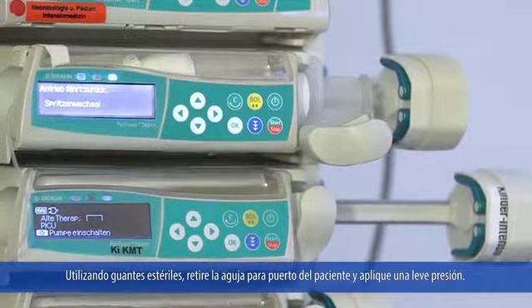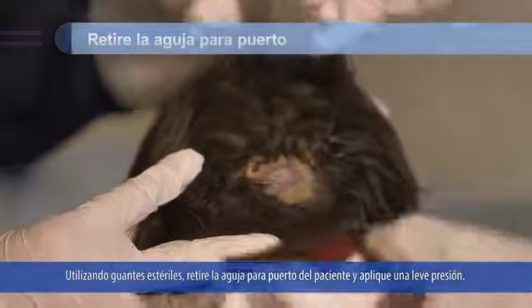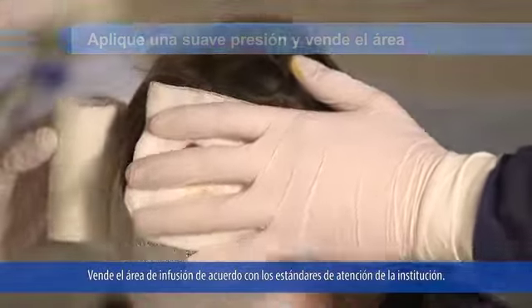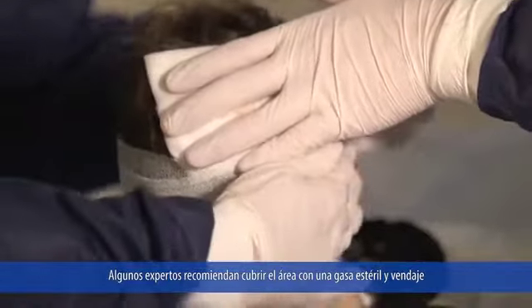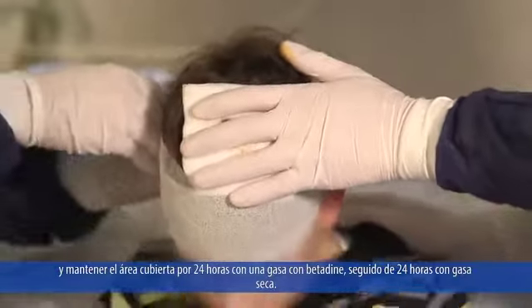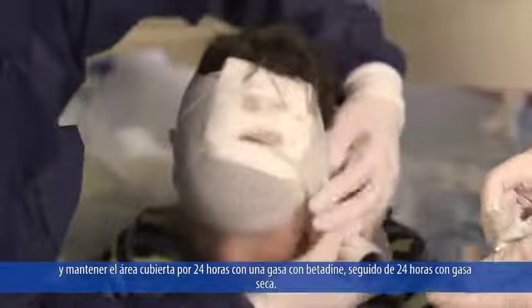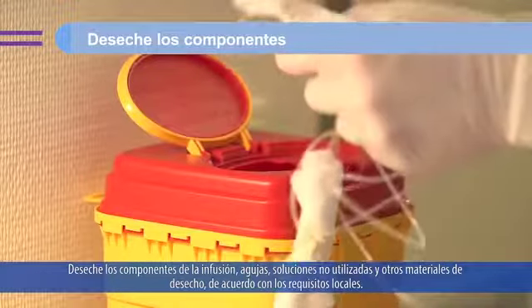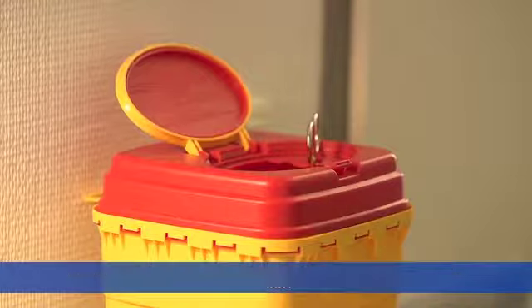Wearing sterile gloves, remove the port needle from the patient and apply gentle pressure. Bandage the infusion site as per the institution standard of care. Some experts recommend covering the insertion site with sterile tissue and a bandage and keeping the site covered for 24 hours with betadine gauze, followed by 24 hours with dry gauze. Dispose of the infusion components, needles, unused solutions, and other waste materials in accordance with local requirements.